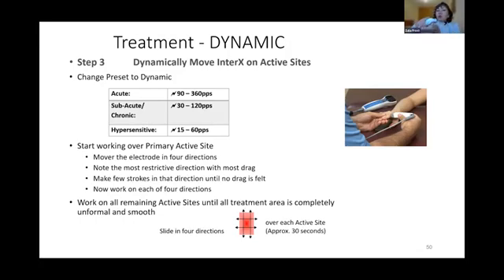So once you achieve this, again, very slowly check all your 4 directions and see now which direction becomes most restrictive. And it will be different. And you can do this until all 4 directions become more or less moving and they have sound. When you hear the sound coming back from the tissue, that means the energy is not being absorbed any longer, so you can move on, okay? Even if there is still a degree of stickiness, don't worry. The body already understood and you charged the tissues already.